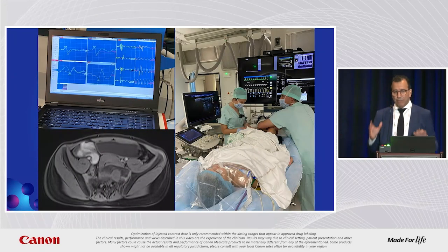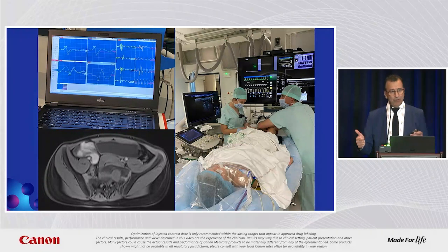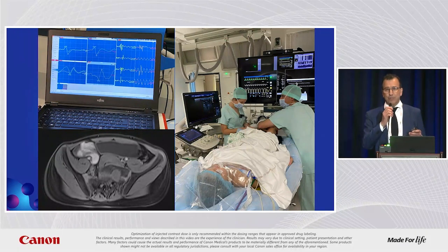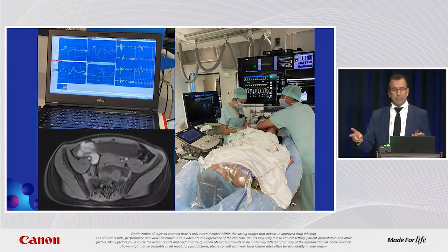So what we have done, first step, monitoring. We are very near the sciatic nerve, and one of the complaints of the girl is sciatic pain. So I need to monitor the patient. Electrophysiology is the first step. In France, we have big difficulty getting neuromonitoring. So 2 guys of my team learned how to do it. Finally, we are very good because with ultrasound, you can find the muscle easily. It's not difficult to learn, but we bought the machine ourselves. We have our own neuromonitoring. All these patients, again, are under general anesthesia.